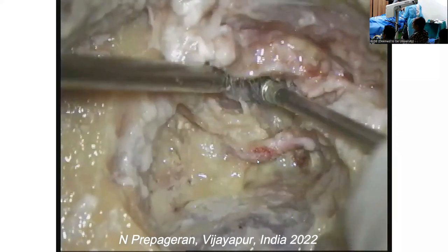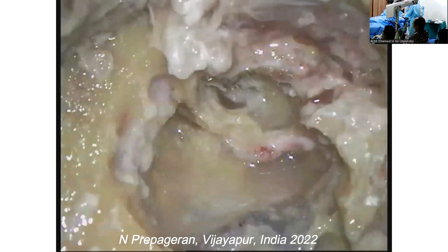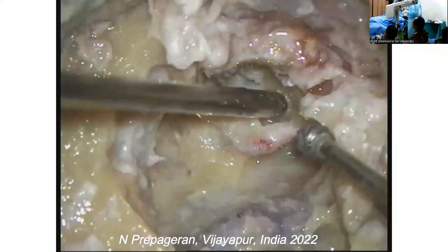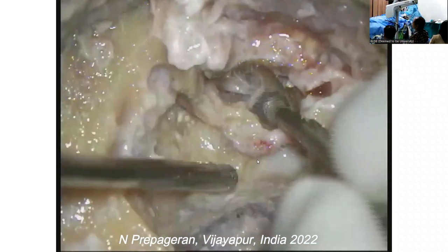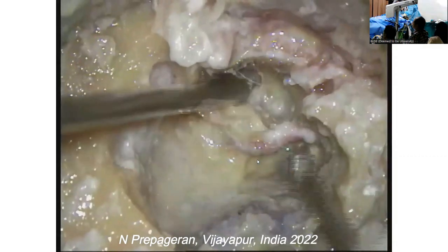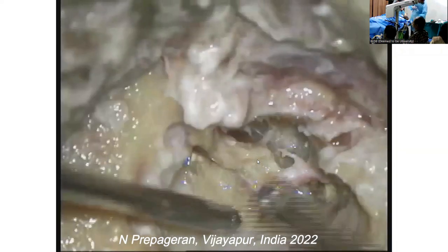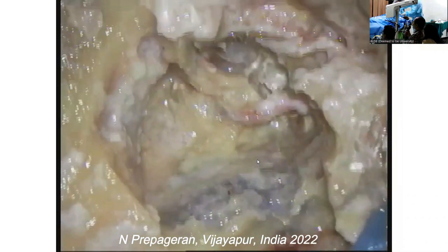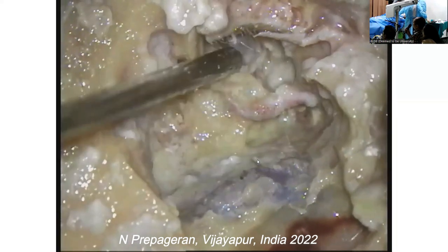Maybe you just give me the cutting diamond again. I'm scared I can't control this burr. Okay, so I'm going to go to the hypotympanum. And that's the jugular bulb, guys. Can you see? Yes, sir. Okay, give me a diamond. Okay, good.